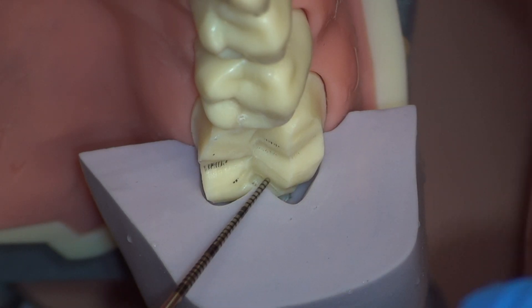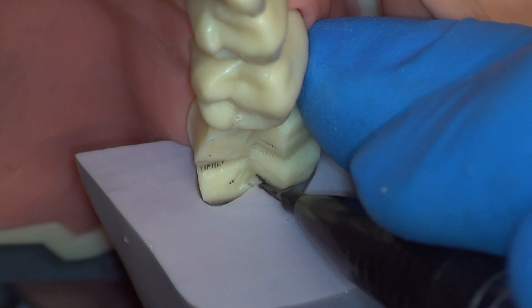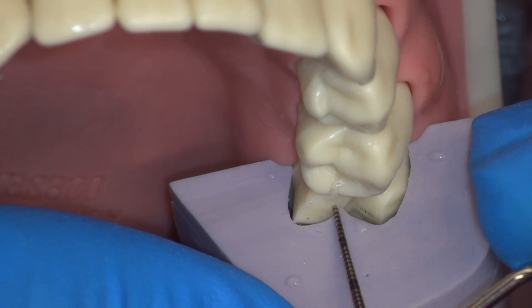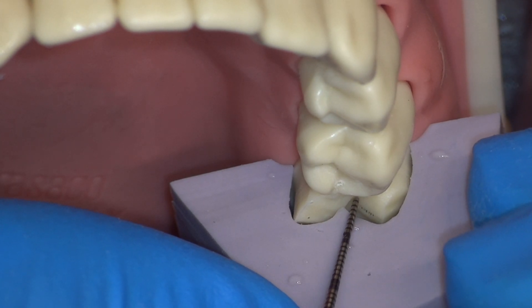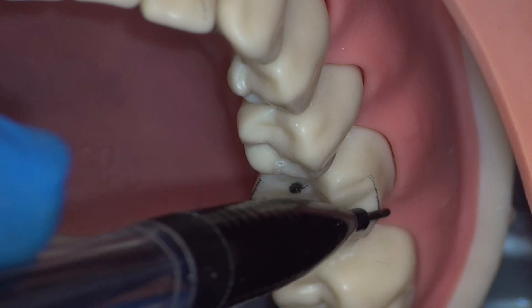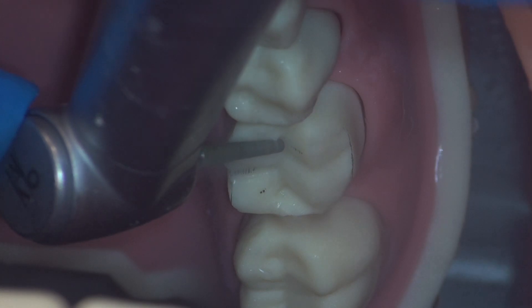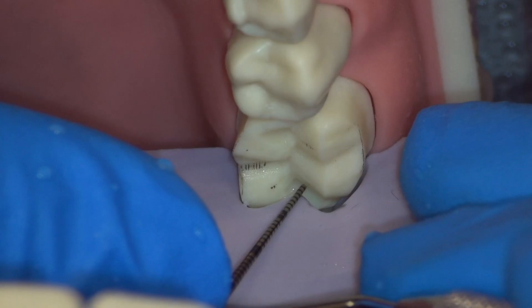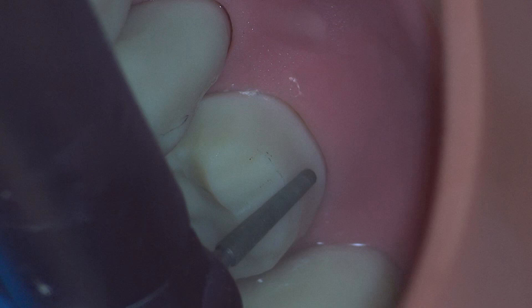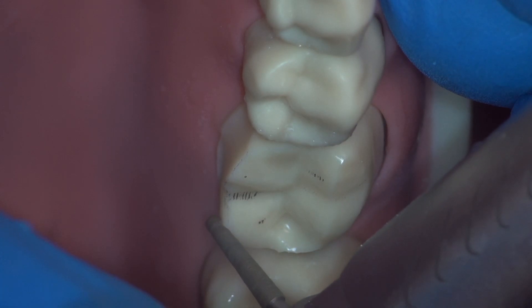Checking occlusal reduction, find and mark any areas that are under-reduced. This spot has 1 millimeter of reduction where it should be 1.5. Note the amount of reduction needed such that decisive corrections can be made. This spot has 0.5 millimeters of reduction where it should have 1 millimeter. We also mark the lingual and buccal areas that have not yet been reduced. We adjust each of the marked areas by the amount required. Remember that half a millimeter is half of the diameter of the modified shoulder burr we're using. On reevaluation we can see the correct depth measurement. We adjust the buccal and lingual untouched areas by adding a 0.5 to 1 millimeter bevel. Check the new clearance with the putty reduction guide. The same is repeated on the lingual side.